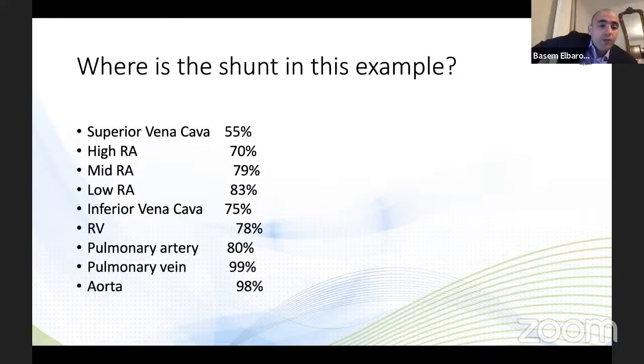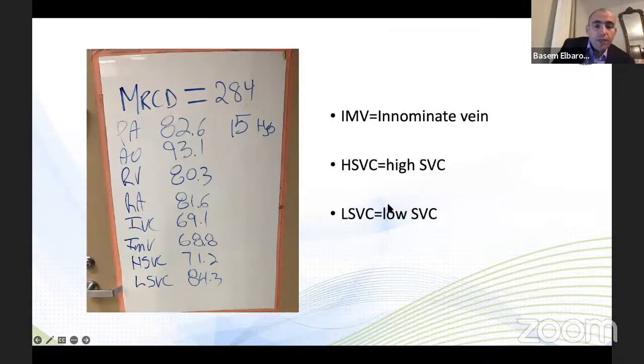Okay. Now, in real practice, most cases would be diagnosed already with echo or a cardiac MRI, non-invasively, but once in a while we'll have a case like that. This is a shunt run that I did in my lab. This is a case that I did. And usually when we're doing the samples, the nurse will write it on a whiteboard so we can all see it there and see what's going on instead of trying to remember it in our minds.